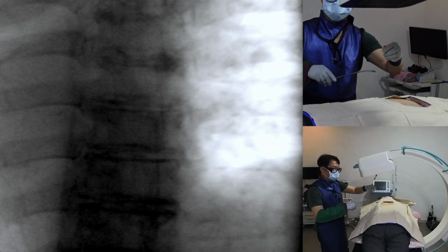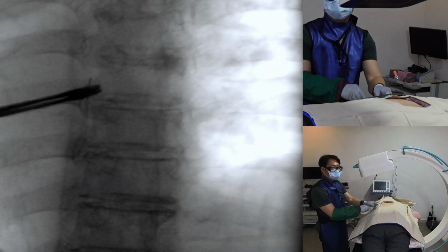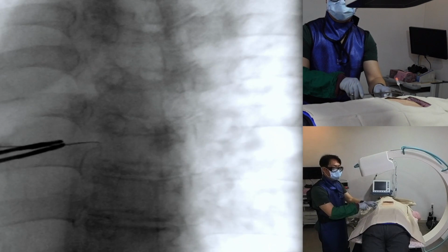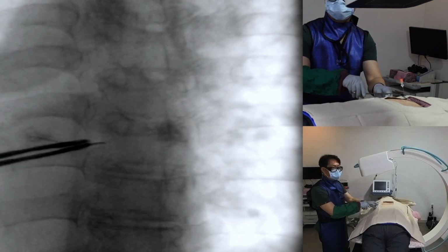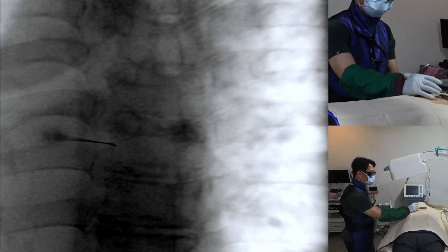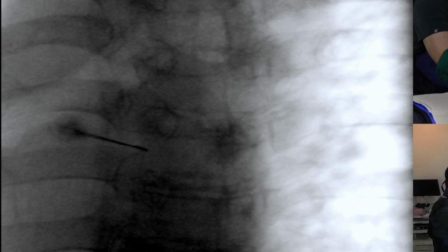Next, I am looking for a clear window for the intervertebral space. Typically, there is a window between the inferior lamina of the upper level and the ribs of the lower level in the oblique image. Unfortunately, the window is not as clear as in previous patients. The C-arm image shows more disc height loss, marginal sclerosis, and a narrower, blurred window.